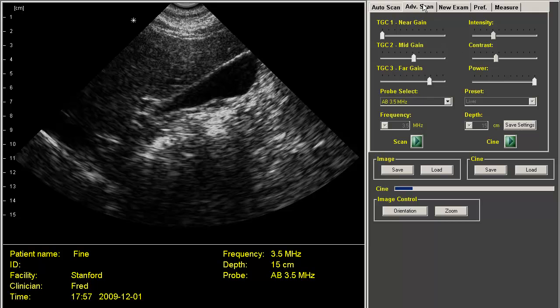The next tab is the advanced scan tab, and here we have controls that allow you to adjust the gain in the near field, the mid field, and the far field. It also includes the same intensity and contrast controls. This is a way you can fine-tune your image quality.